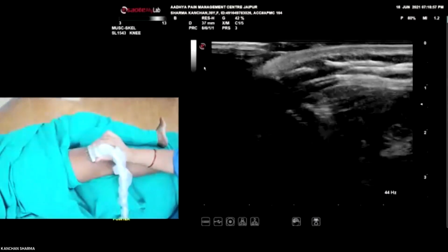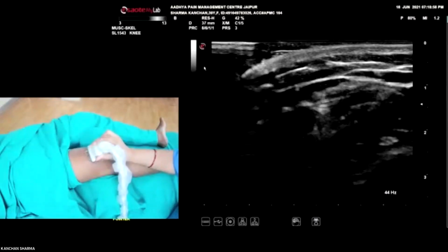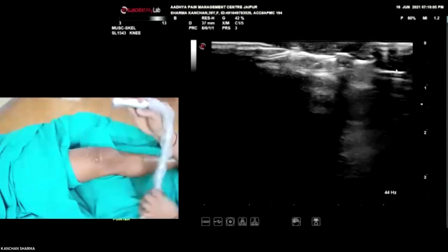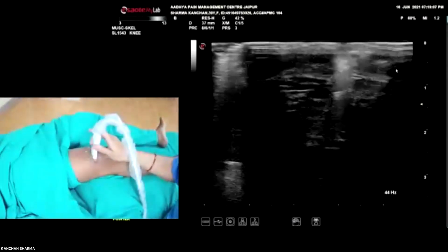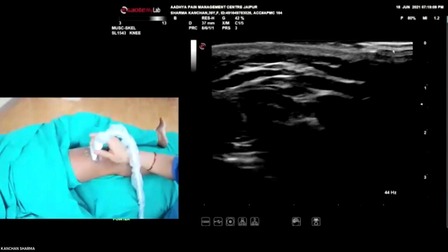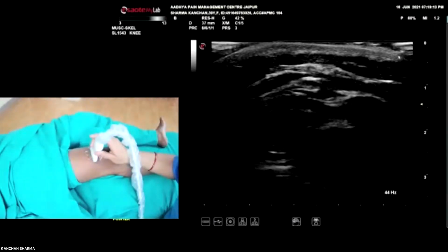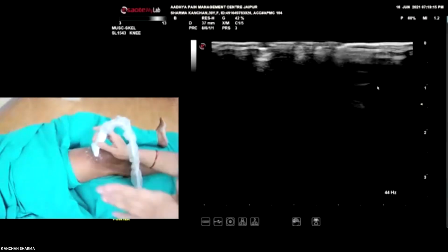What you are able to see are jerky movements on the ultrasound. Let me show you. Let me put the arrow. So earlier my aspect marker was like this, so the light is towards me. So this was the lateral and this was the medial. This is how the patient, the volunteer, is lying down.